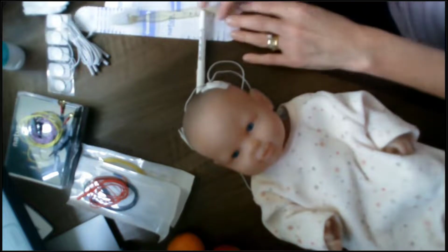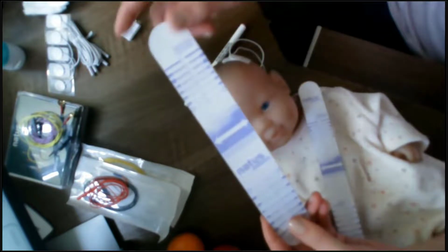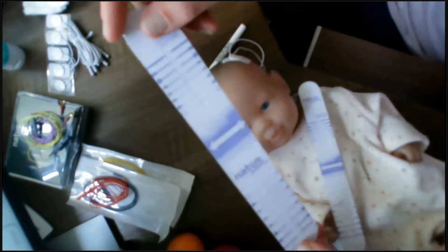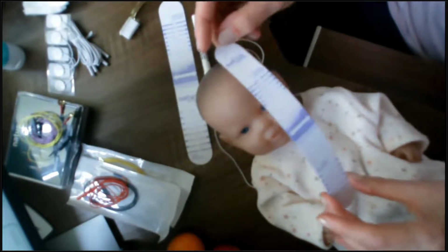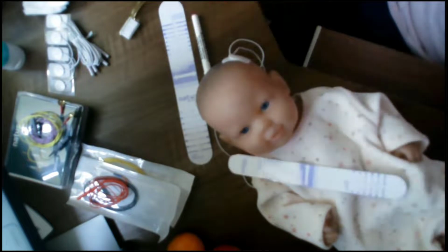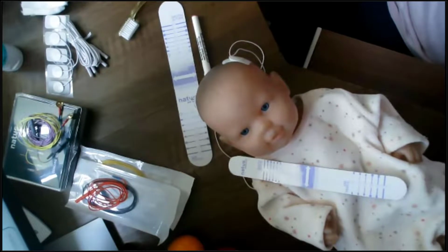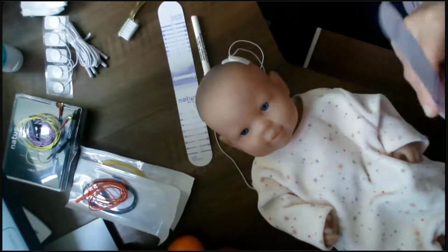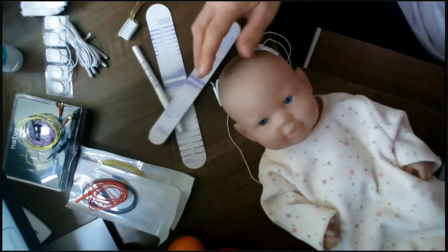Now, we talked about the positioning aid. The positioning aid comes in two different sizes. The bigger size is the size that we would use for the full-term babies, and the smaller size is the one that we would use for the smaller head circumferences or preterm babies. Just noticing that my camera is slightly out of focus there, so I'll try to make that a little bit better for you. Okay, so again, I'll practically show you how this positioning aid works.